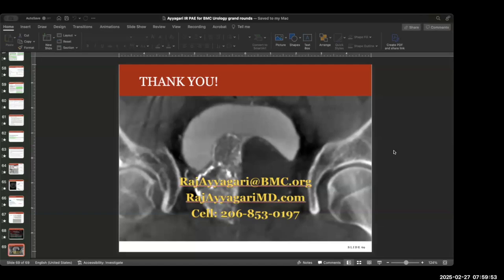Well, you can always do bilateral femoral access if you need to, just so you don't have to deal with going over the bifurcation. Those are good patients for radial access too, if you get facile with that. But again, once you've done pelvic angiography, you can get used to that challenge. And it's nice to have certain specialty vascular sheaths, longer curved sheaths, so once you get up and over, you can keep the sheath up and over and maintain a more secure access. I don't know if you have those, but they are very helpful for certain cases. Thank you.